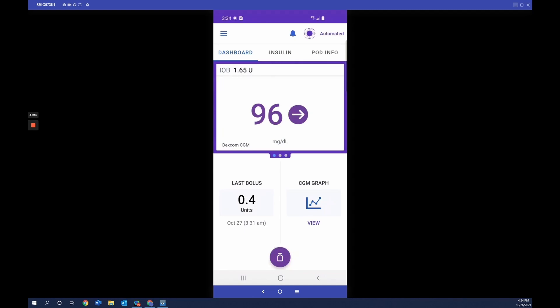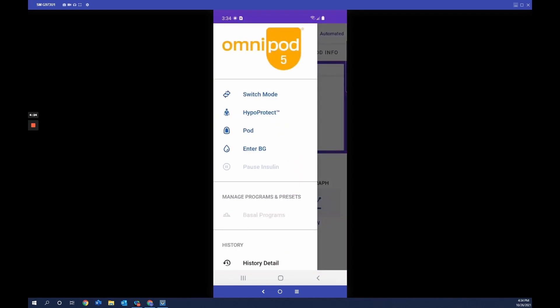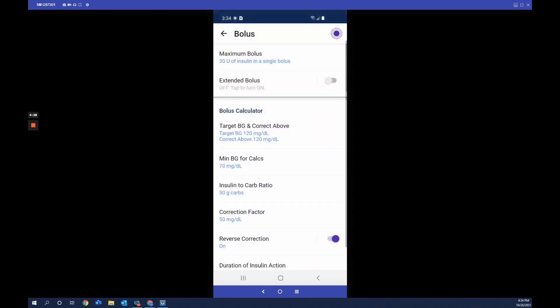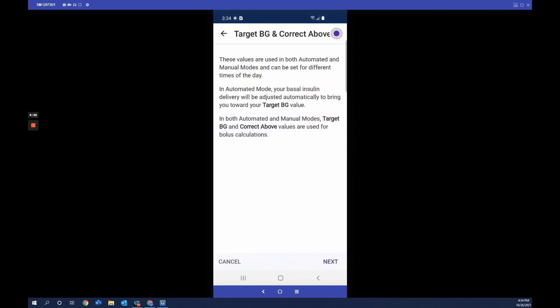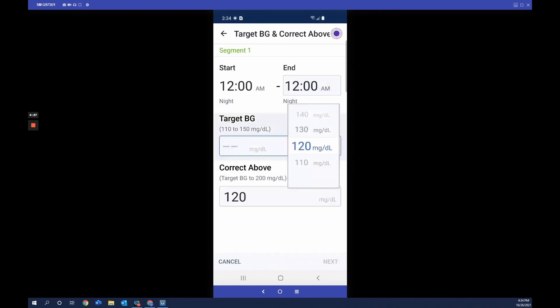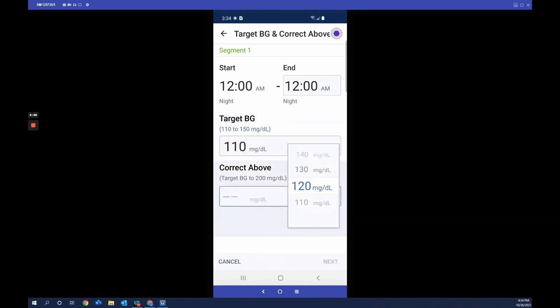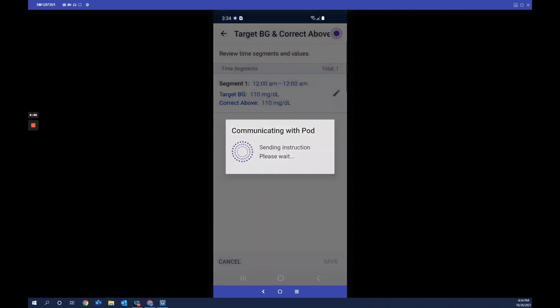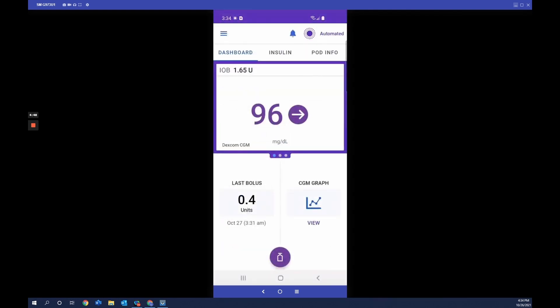Back in automated mode, to change your target glucose, tap the menu button, then Settings, then Bolus, then Target Glucose. Tap on the segment you wish to adjust and change the value — for example, from 120 to 110 mg/dL — then save it. The insulin delivery will automatically adjust to bring glucose toward your chosen target, which can be set from 110 to 150 mg/dL in increments of 10 mg/dL, with up to eight different profiles throughout the day. This is the Omnipod 5 app, designed to simplify life with diabetes.